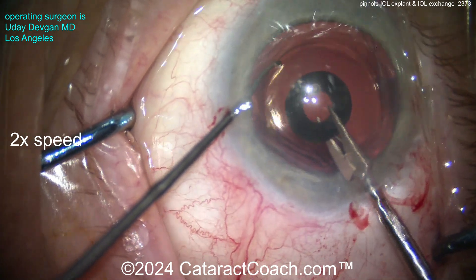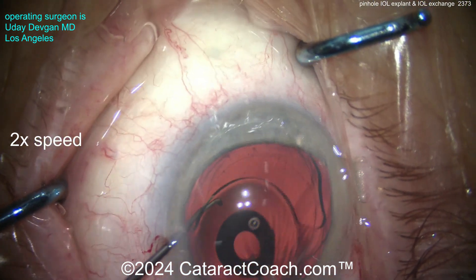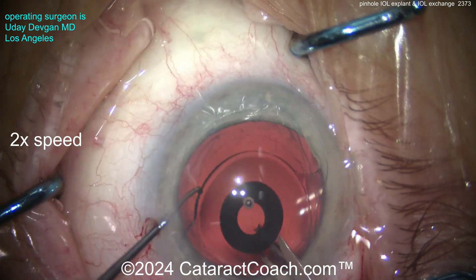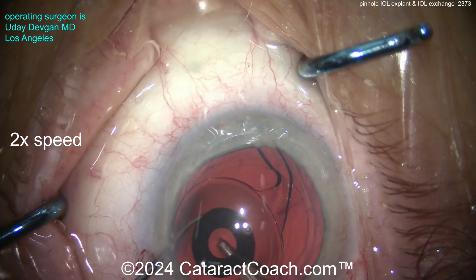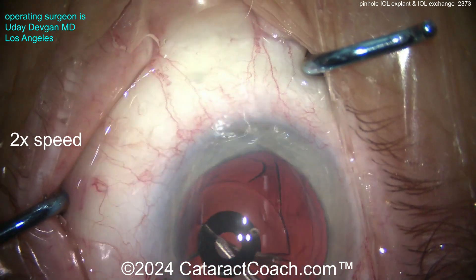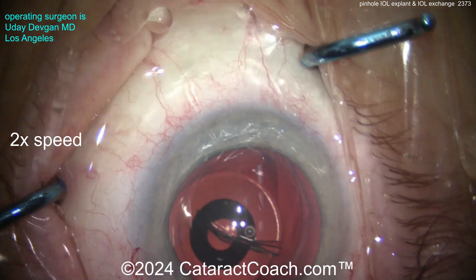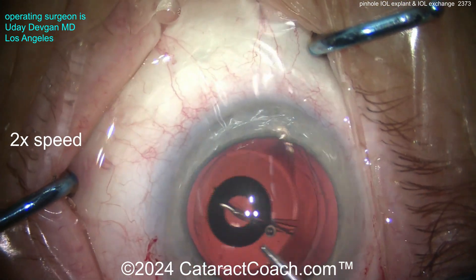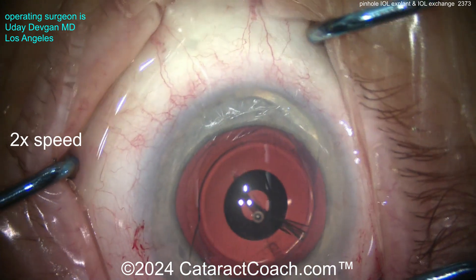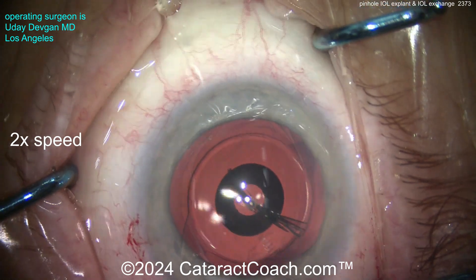The eye is full of viscoelastic — there's a big cushion protecting the posterior capsule. Using the chopper to help grab the lens, and we're going to cut it with scissors. I don't want to enlarge the incision any more than we have to, so we'll cut it halfway and then rotate the lens and cut in the other direction.